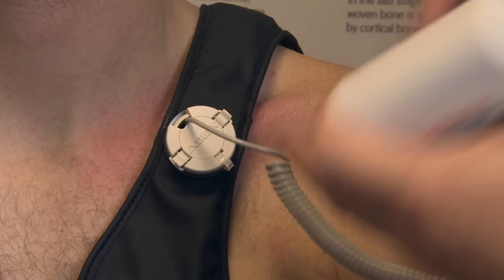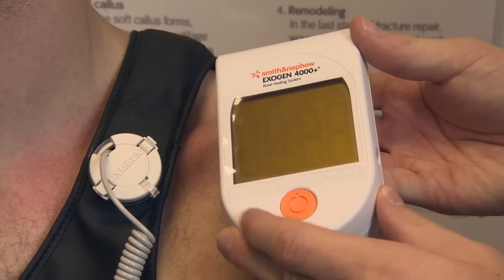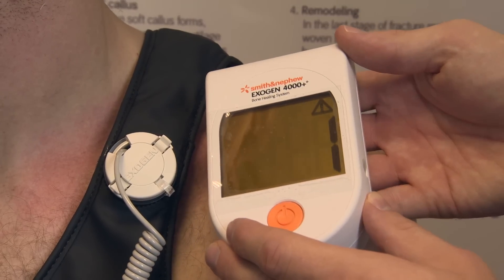Click the cap shut, and all you need to do then is press the orange button, and the device will count down from 20 minutes down to zero.